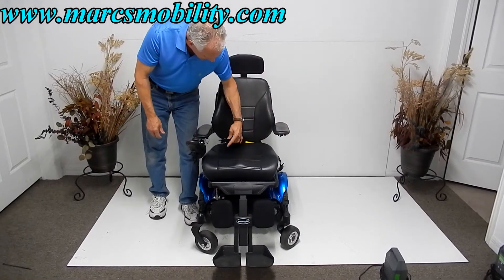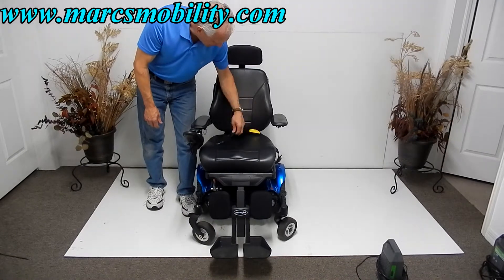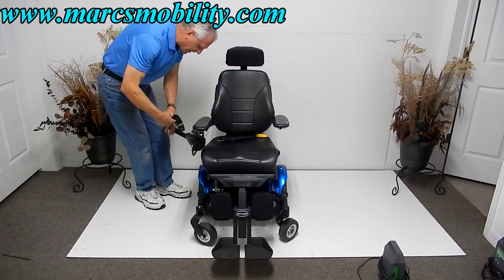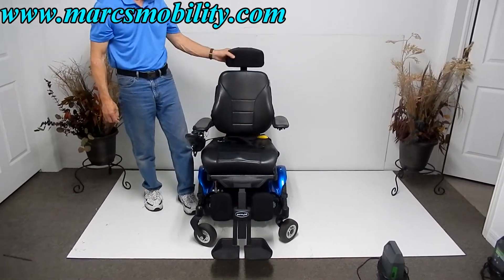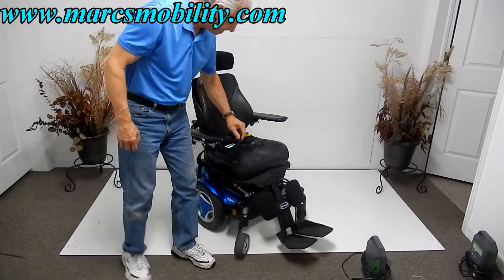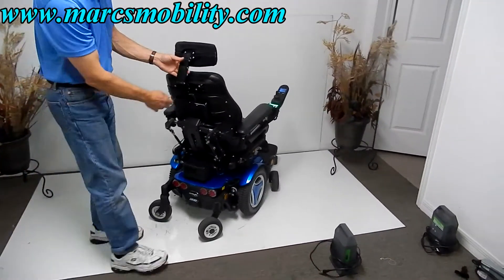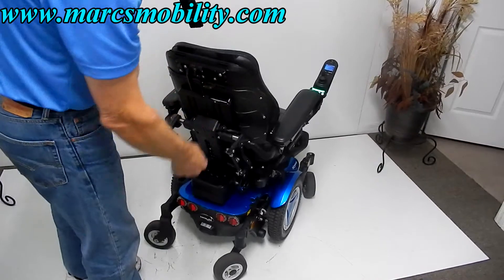You do have a safety belt here. You have an adjustable headrest — as you can see, the headrest is fully adjustable and it can be removed.